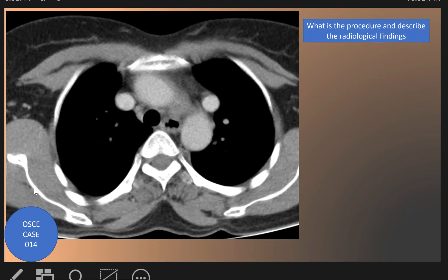The procedure here is CT of the chest. We see an enhancing vessel lateral to the aorta. This is the ascending, this is the descending, and this is the vessel enhancing, as large as the right superior vena cava.